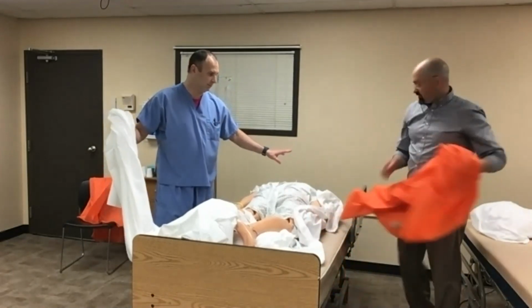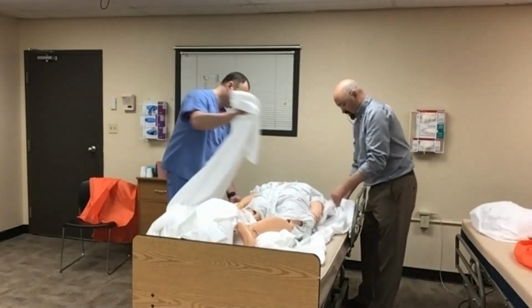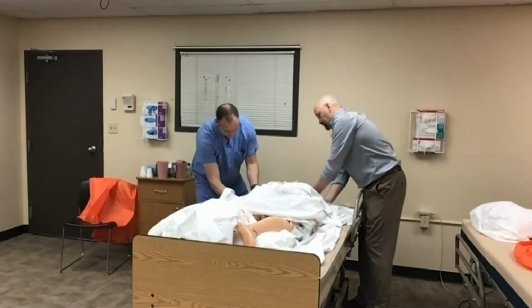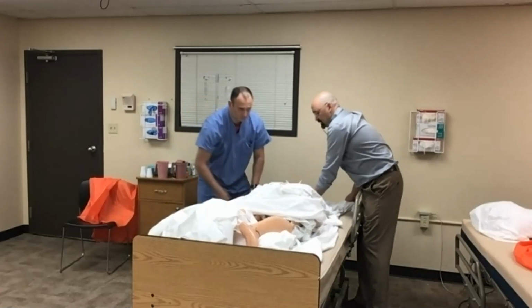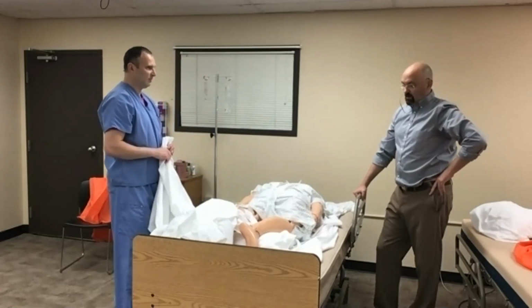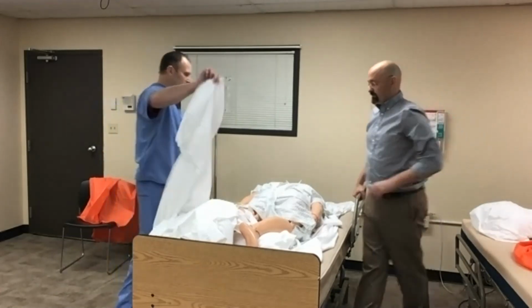Now, after you get into here, you saw that fold that we did here, the 14 inches. So what I can do now is grab that, and just gently pull, and then we are covering the entire surface. So to supine him, we're going to do the exact same thing, except backwards. We're going to take our flat sheet.